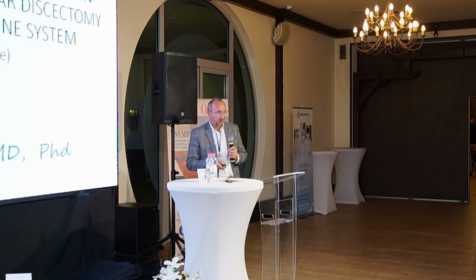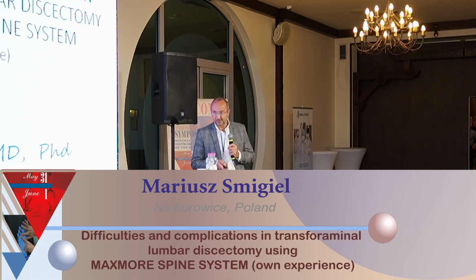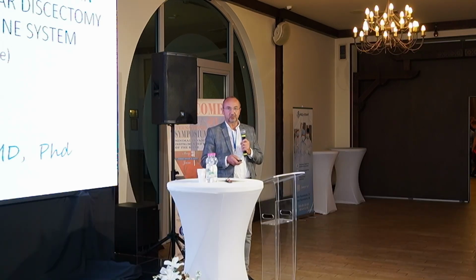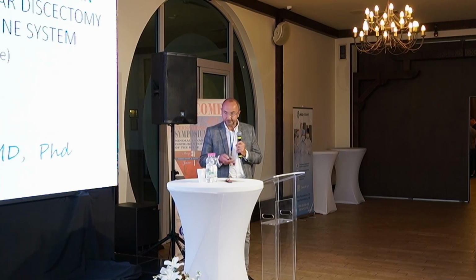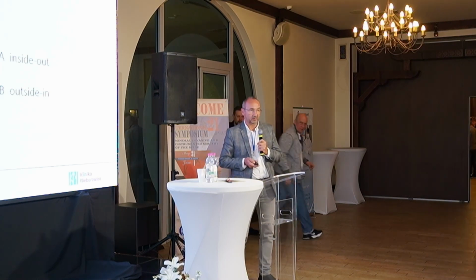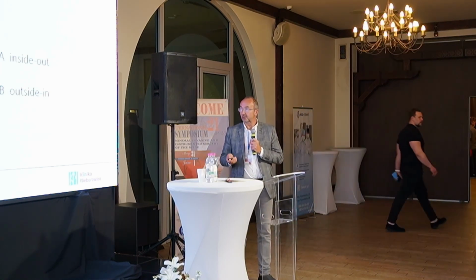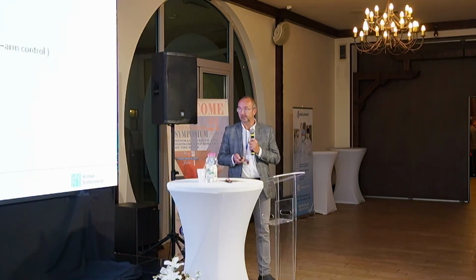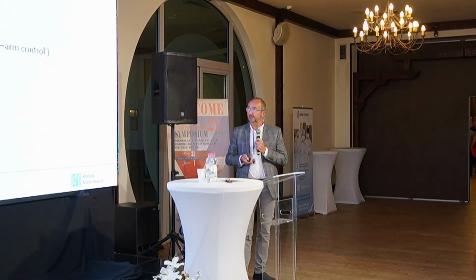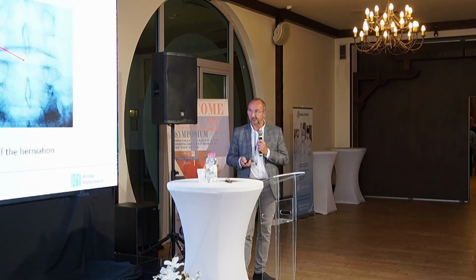Thank you. I would like to tell you about problems and complications we encounter during transforaminal lumbar discectomy. I do the outside-in method using MAXMORE instruments. So the goal is to go inside the spinal canal. And the transforaminal method consists of two parts. The first one is under C-arm control without endoscopy, and the second part is endoscopy.